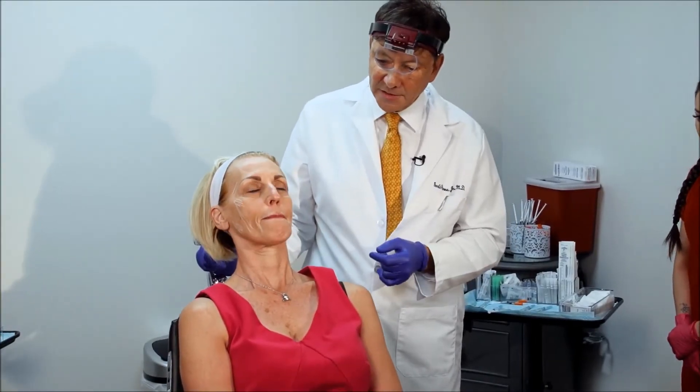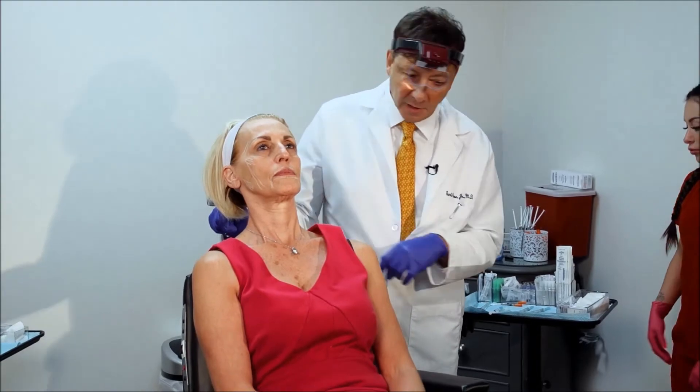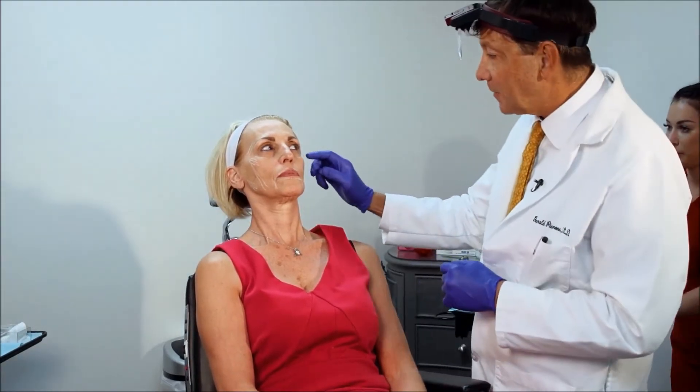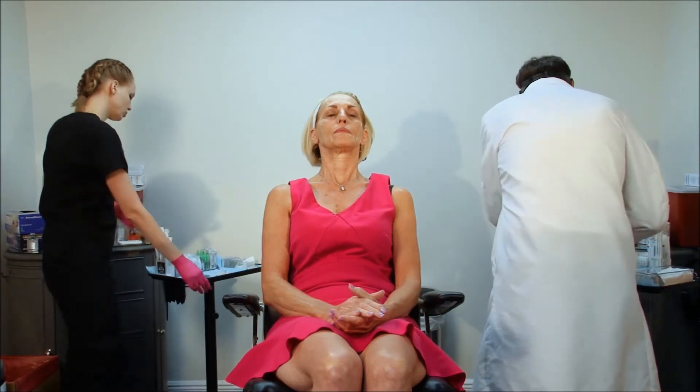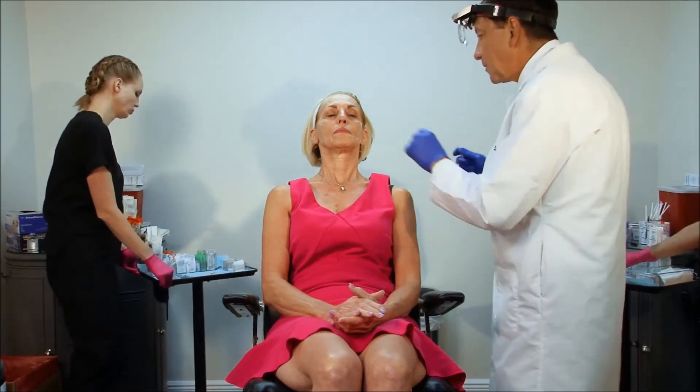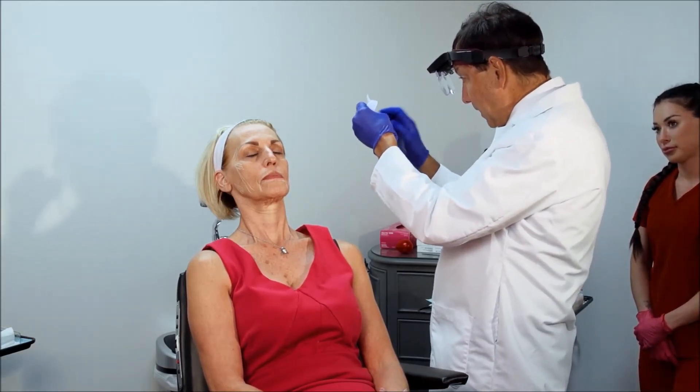The first thing I'm going to do is start by injecting lidocaine with epinephrine and bicarb into some of the areas where we're going to be doing the microcannula. When we add bicarb to lidocaine with epinephrine, it makes it less painful. People talk about lidocaine burning — by putting bicarb in there, it makes it less painful.